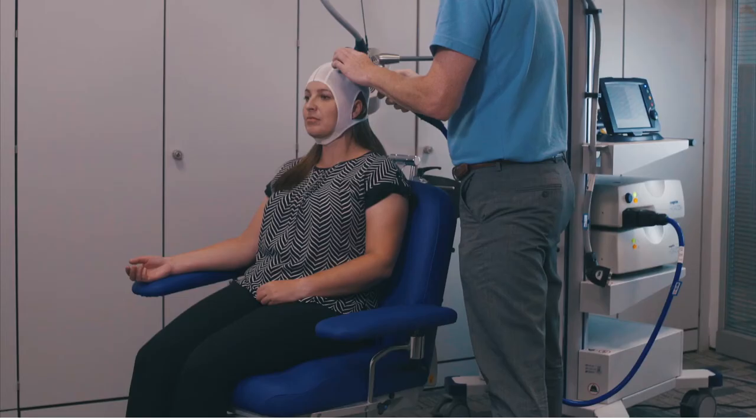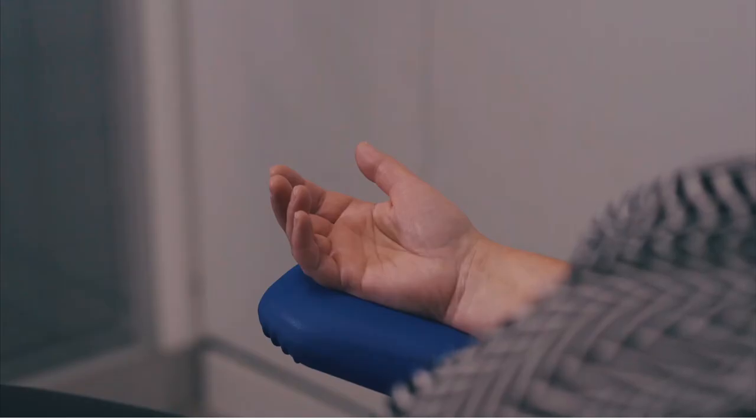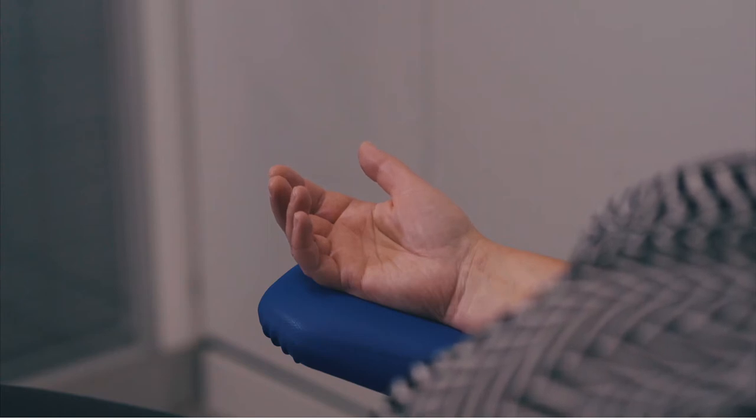Using the coil up and down buttons to adjust the power, follow the first flow chart in the operating manual to find the optimum power for hotspot hunting. Ask the patient to briefly clench and relax their hand after each pulse.